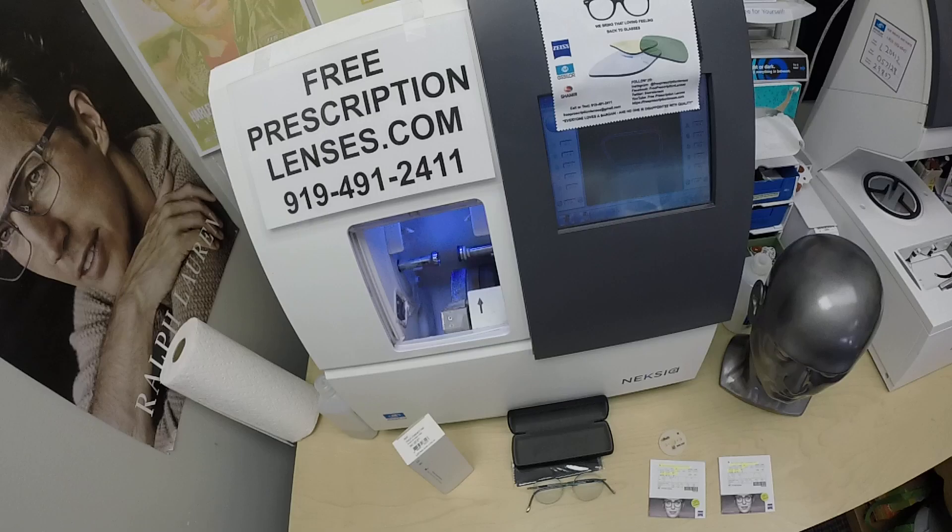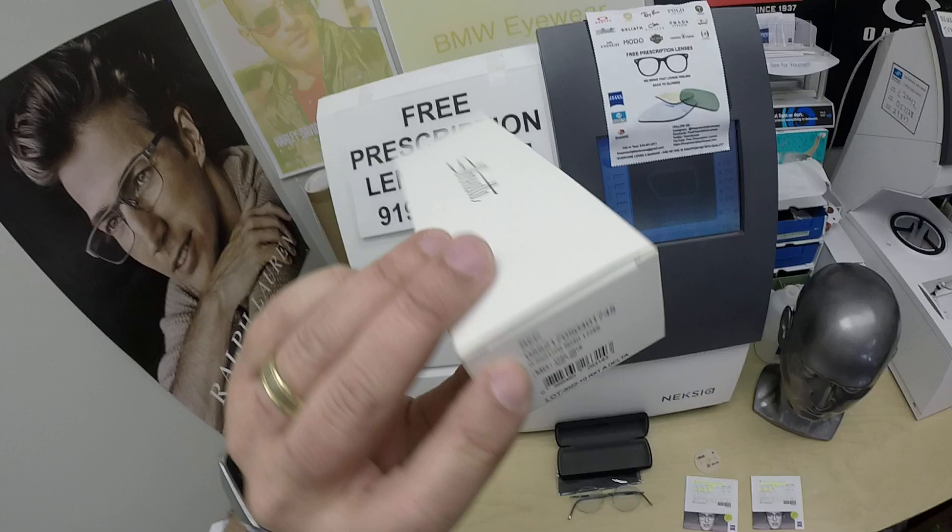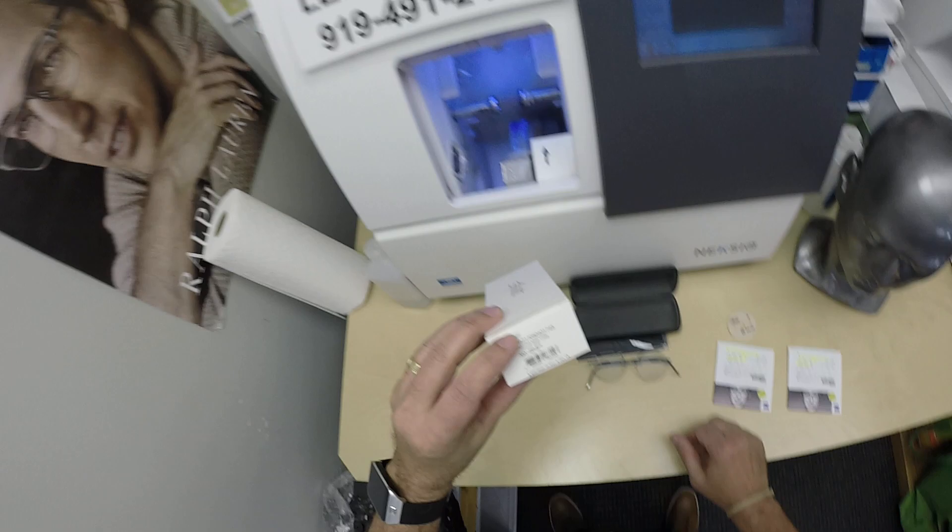My name is Moe Better — call me Moe — because I might be seeing Moe Better, looking Moe Better, and I show everyone how I bring that loving feeling back to glasses. Today I'm showing you Macy's Silhouette, model number 5521.